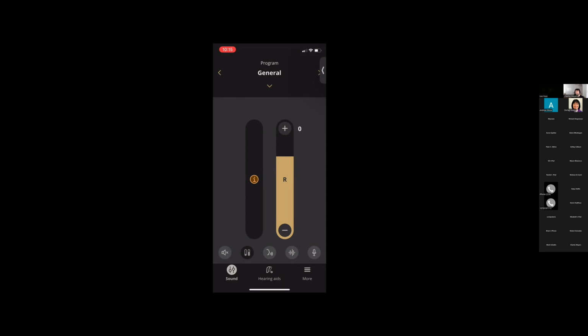So essentially what the hearing aids do is they look, based on the data that your audiologist receives from a hearing test, and they say, okay, well, Charles was low in this area. He needs assistance with these ranges of hearing. So for me, that's the higher pitch. So my hearing aids have a louder volume at the higher pitch of hearing.